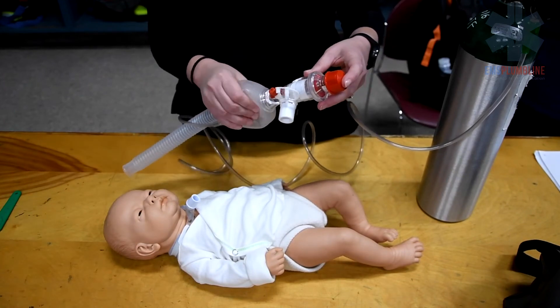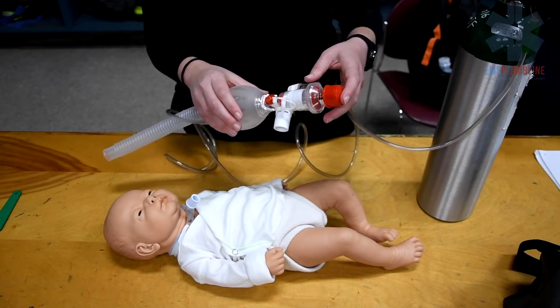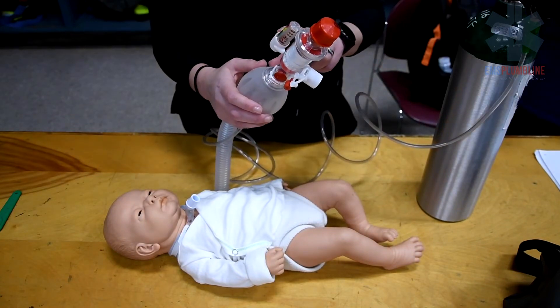A pressure gauge may be found with smaller Ambu bags. This allows a clear visual of how much pressure is being used during bagging. It is located on the side of the bag, shown here with red, yellow, and green indicators.